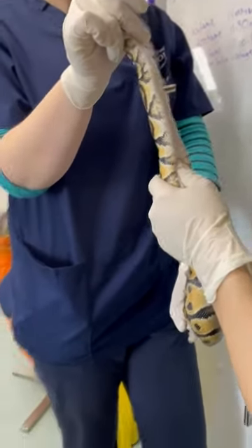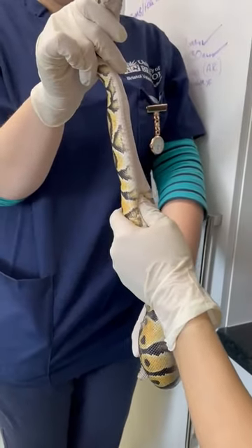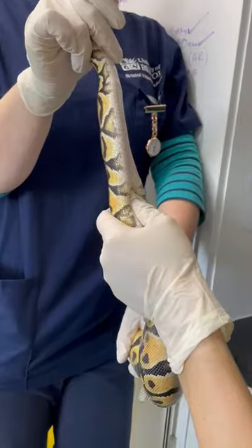So today we're going to be taking a blood sample from the snake. The first thing is to make sure that he's properly restrained. My handler here is holding his head so that he can't do any biting, and we're supporting the body nicely.